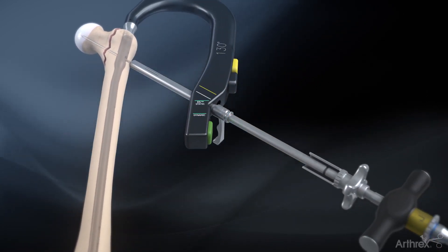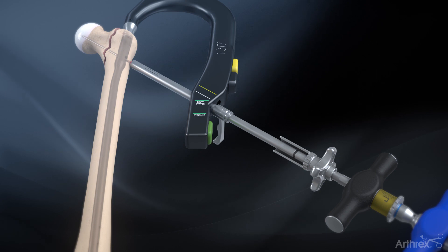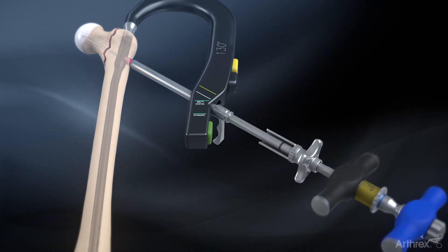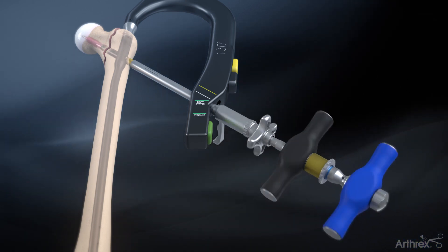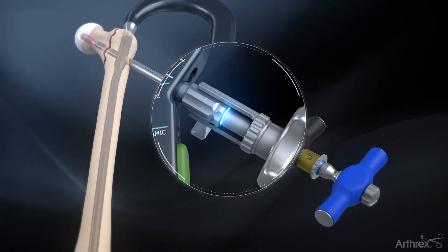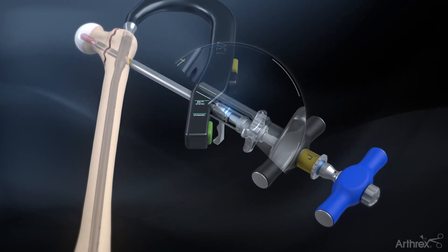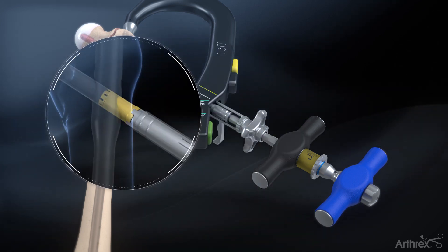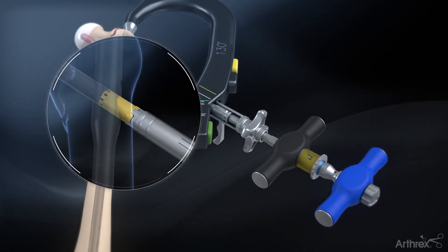Slide the lag screw inserter assembly over the guide pin and through the lag screw sheath. Rotate the assembly clockwise with the blue handle. When the black laser marking on the inserter reaches the sheath, the lag screw has exited the other end of the sheath. It is recommended to insert the lag screw further if intraoperative compression is planned.